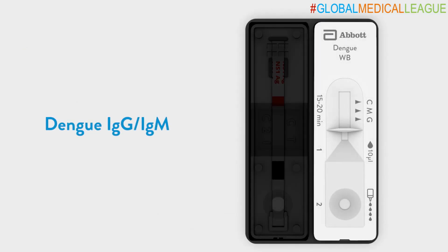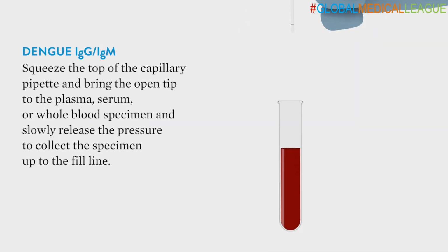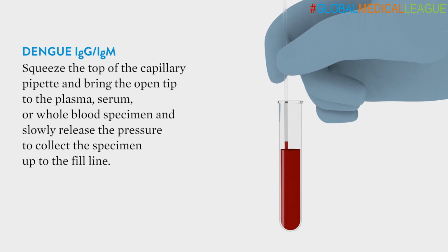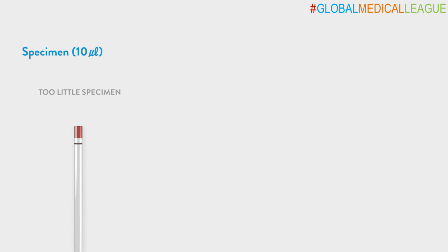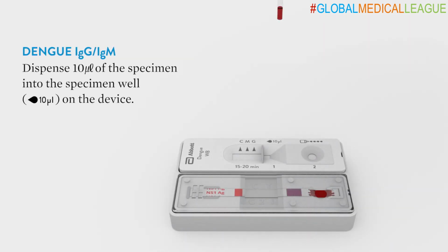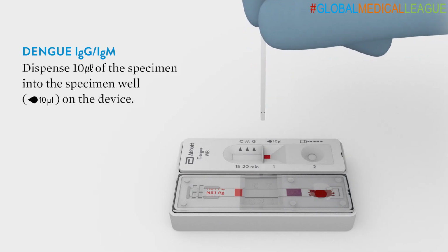Now let's move on to the IgG/IgM test. Squeeze the top of the capillary pipette and bring the open tip to the plasma, serum, or whole blood, and slowly release the pressure to collect the specimen up to the fill line. Make sure to collect 10 microliters up to the fill line. Dispense 10 microliters of specimen into the specimen well on the device.